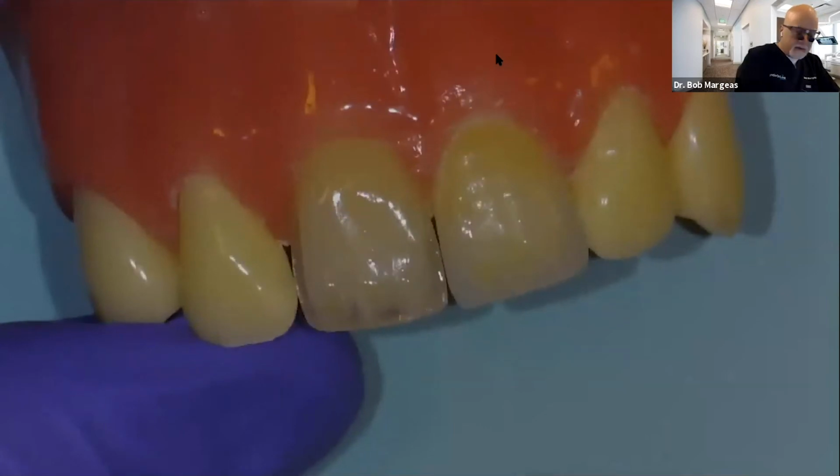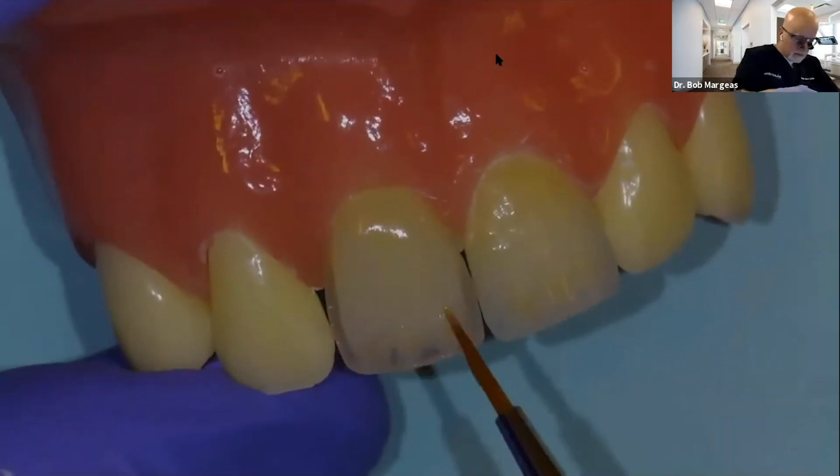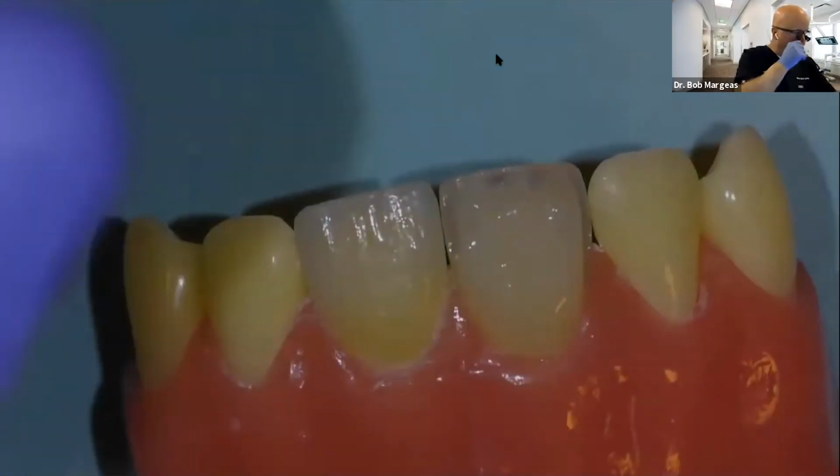All right. So now I want to do my final interproximal. This is where I'm going to use an achromatic shade of composite. I'm going to use the enamel white. If it was Filtek Supreme, it would be like a WE. If it was Renamel, it might be like a milky white occlusal.